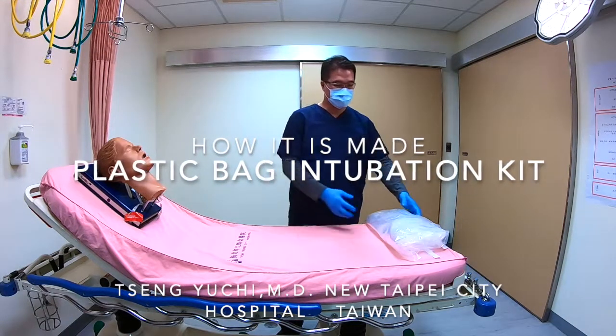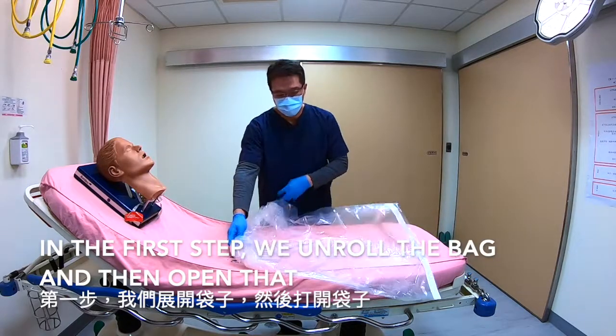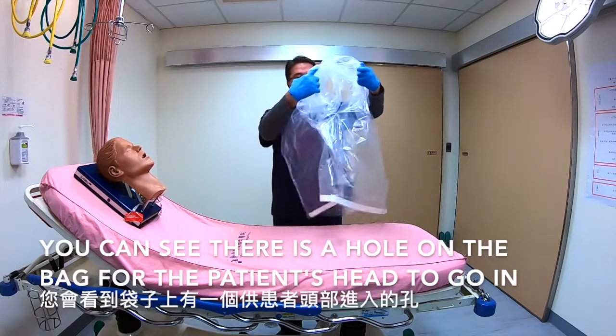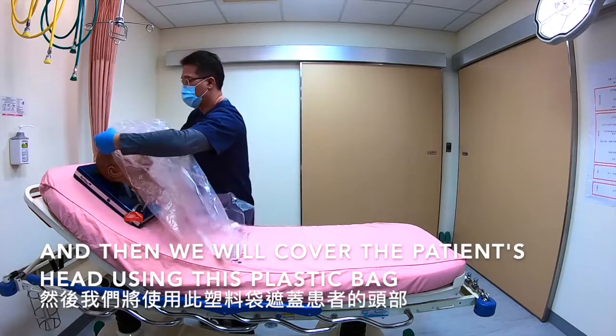This is our bag intubation kit. The first step is to unroll the bag and then open it. You can see there's a hole on the bag for the patient's head to go in. We'll cover the patient's head using the plastic bag.